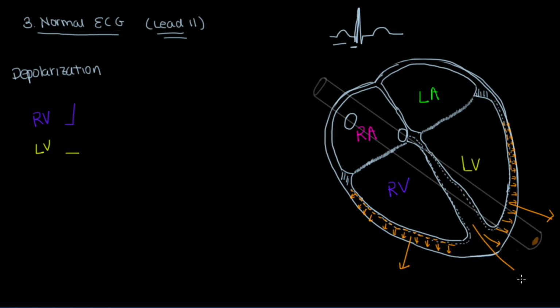In any case, the overall charge is probably kind of like this, a very large one going down that way. So how we can illustrate that with the left ventricle, it's probably going to look like a very steep one going up this way, right? And then the right ventricle also makes the rest of the waves up and then down.